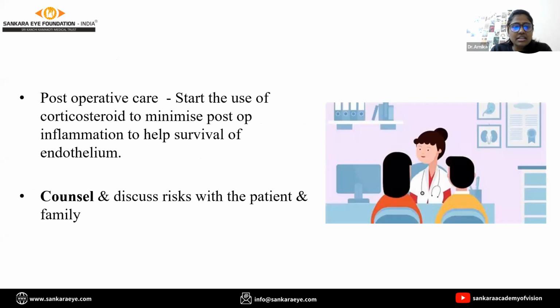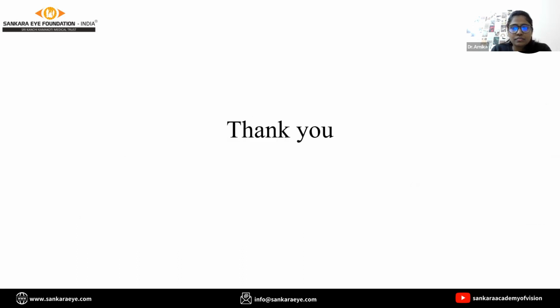Post-operative care: start the use of corticosteroids to minimize post-operative inflammation to help survival of the endothelium. Lastly, and very important, counsel and discuss risks and complications with the patient and the family, and take a proper decision before taking the surgery. Thank you.